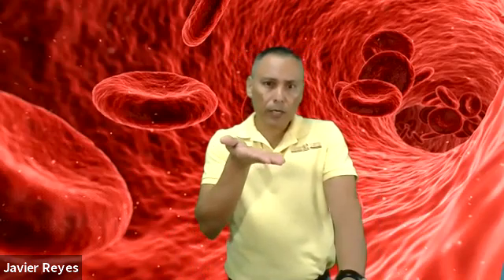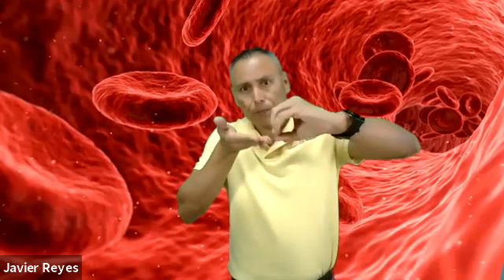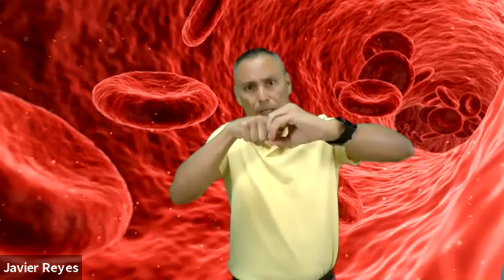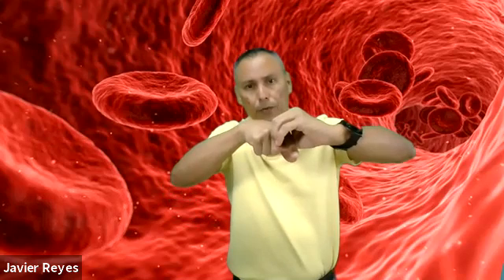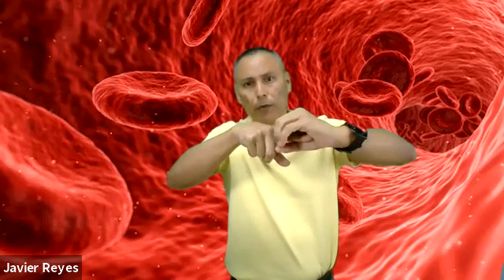So when you insert the needle, you can only imagine, say this is the vein, and the needle goes in. Sometimes the bevel may be partially in, sometimes maybe all the way through. You retract the needle and come back into the vein, and you might get blood draw. Sometimes you go right through it, through the side. So just take a step back and evaluate the process, and make the correction if needed.